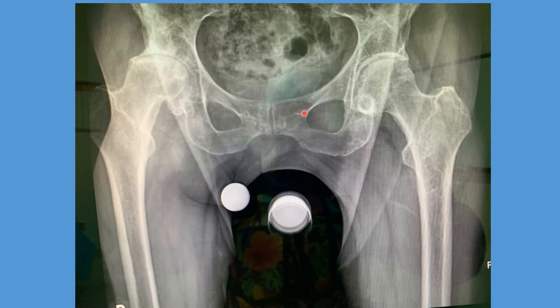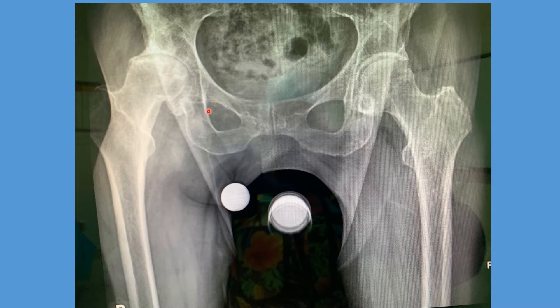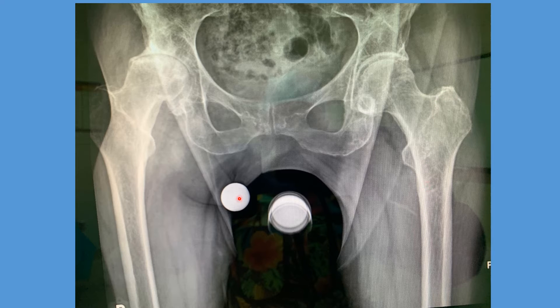So a lot of this is the very technical work to ensure that we have the most accurate starting assessment of the deformity. We place the patient on the back and make sure we have a level pelvis. We can determine that by making sure that landmarks on the pelvis on the left side are equal in size and shape to the opposite side. The pelvis is no longer slanted — it's horizontal — but there are still some rotational issues, and we look at the position of the leg. This femur is straight down, this one is coming in, so we need to do a little bit more refinement before we begin surgical planning.